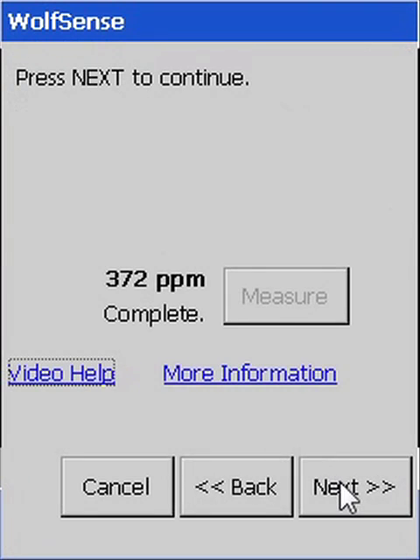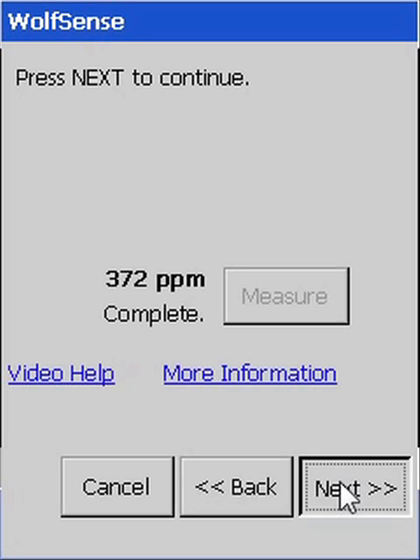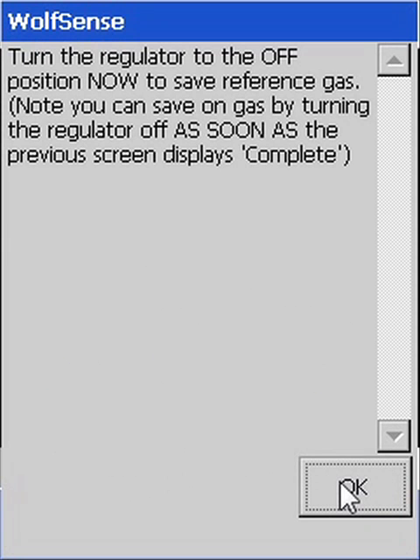Once the countdown is complete, click Next and then turn off the reference gas flow to save your gas.